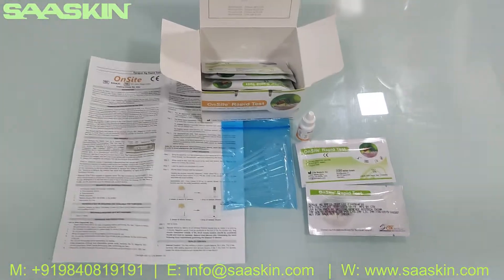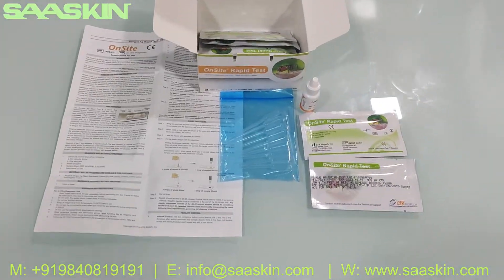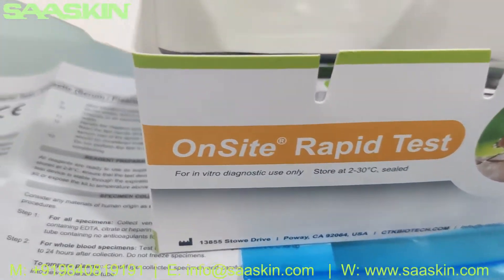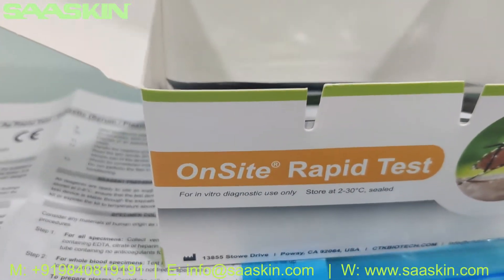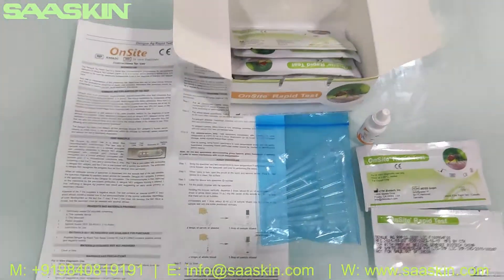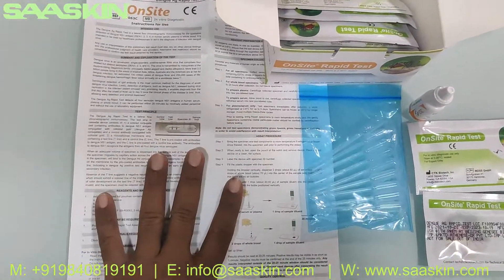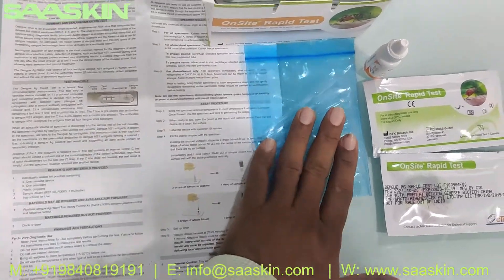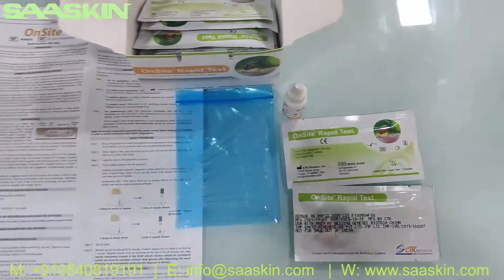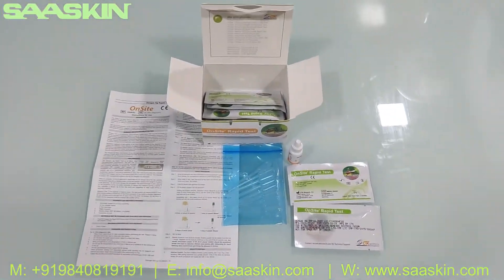You can see the total kit here. To quickly summarize: this is the on-site brand from CTK Biotech, it is a Dengue antigen rabbit test kit, a 10 test kit box. You get the IFU brochure, 10 droppers, 10 test cassettes, and one buffer bottle. This is how the total test kit looks like. Thank you.